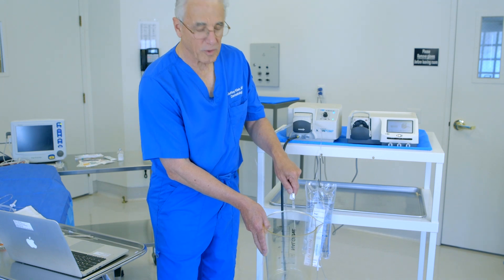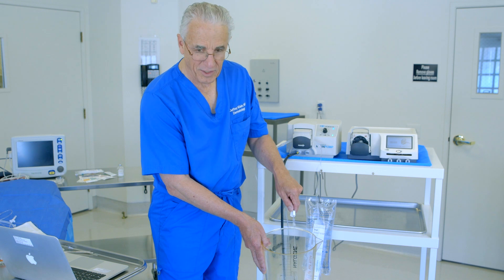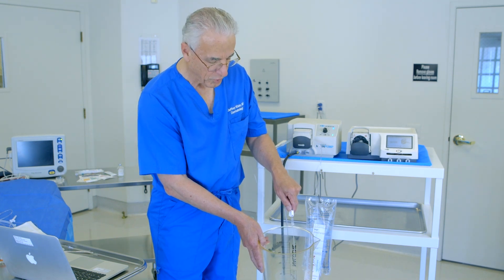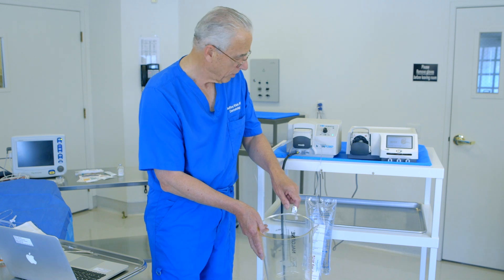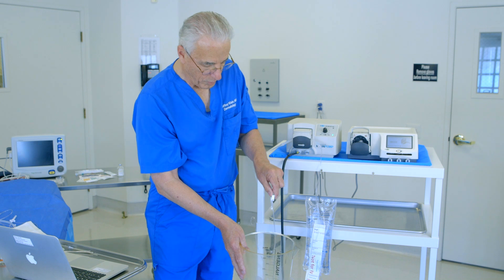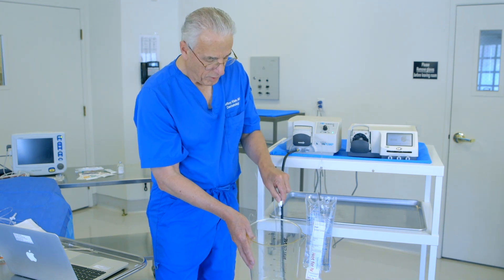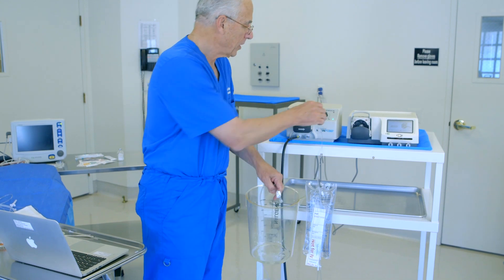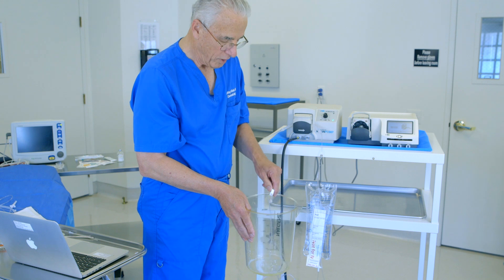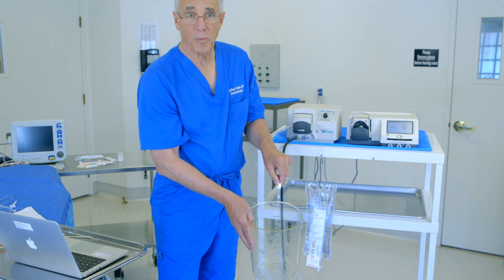Trying to infiltrate large volumes of tumescent anesthesia by hand using a syringe is very tedious and eventually very difficult for the person doing the infiltration. I will turn the rate up a bit and you can see that this can pump quite a bit of fluid. Typically when we're infiltrating under local anesthesia with the patient wide awake, we go at a more moderate rate so that it's not uncomfortable for the patient.